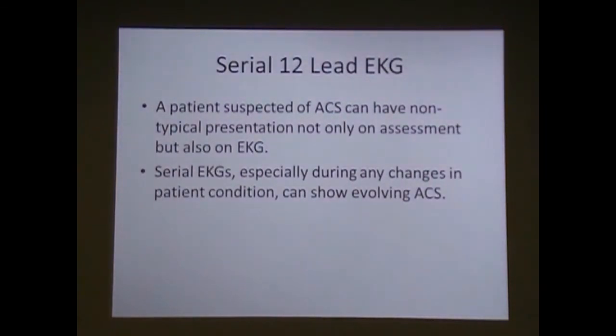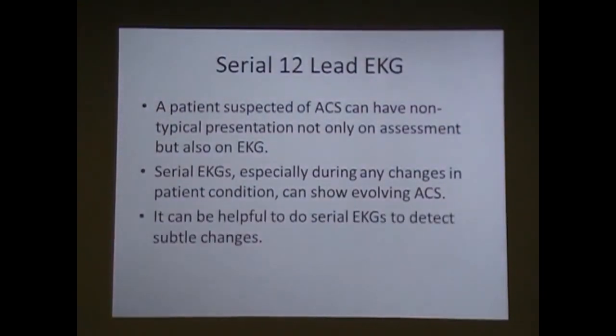Anytime anything changes with my patient, I'm going to be hitting 12 lead. Because if they start developing more chest pain, boom, I do a 12 lead and I show that I've got ST elevation going on with that increasing pain. Guess what? Ticket's been punched, they're off to the cath lab. And it helps detect those subtle changes like I was talking about. And remember, it's only paper. Print it up. We don't mind having extra paper.